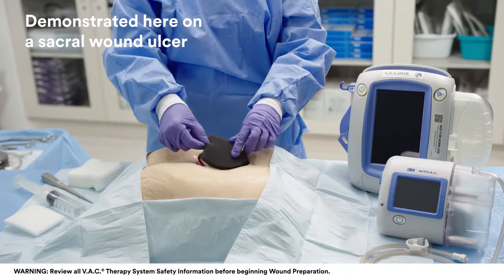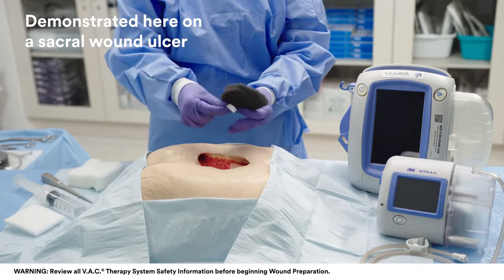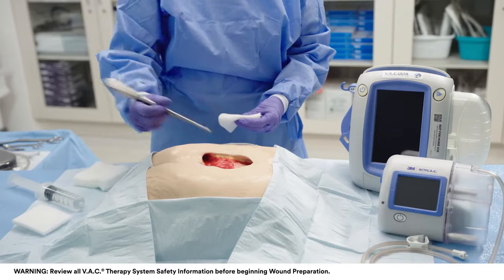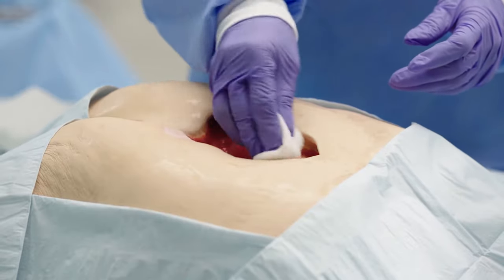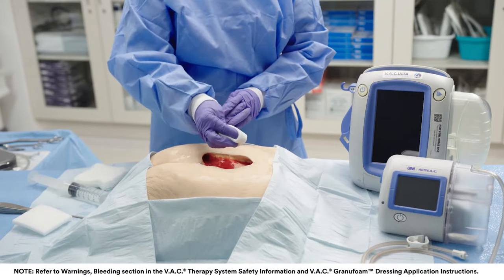Before applying a new dressing, remove and discard the previous dressing per institution protocol. Thoroughly inspect the wound to ensure all pieces of dressing components have been removed. Perform a thorough wound and peri-wound area cleaning per physician order or institution protocol prior to each dressing application. Ensure adequate hemostasis has been achieved.